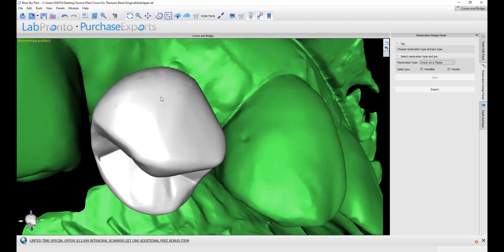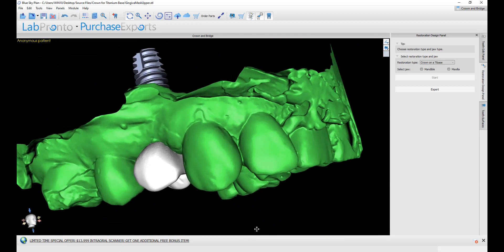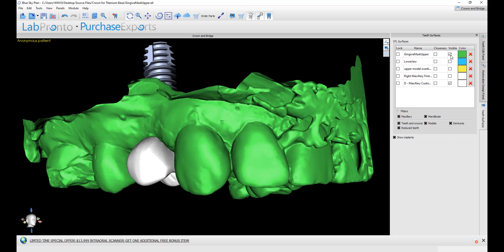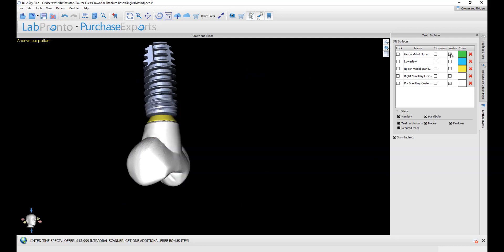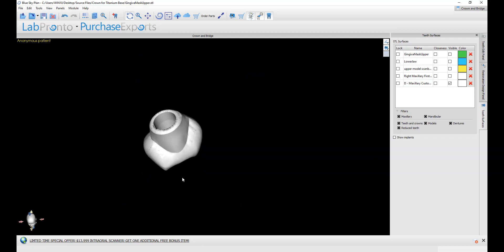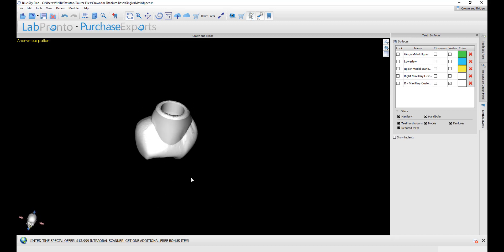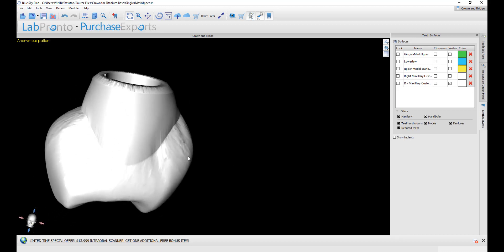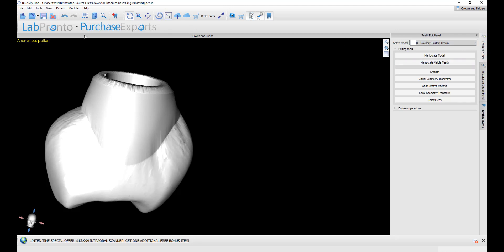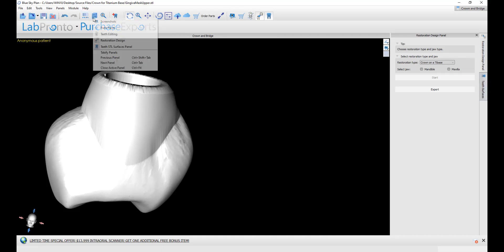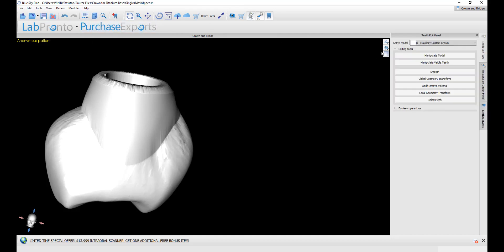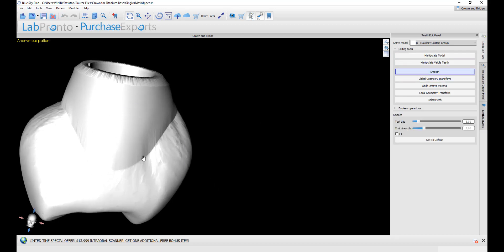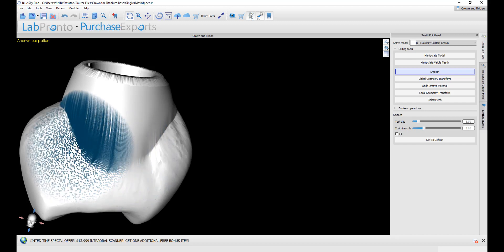We could see our model together with our crown. We could go to the surfaces and here we could toggle on and off different surfaces. We could see our resulting crown. If we want to do any additional editing, smoothing, whatever, then you could go to the teeth edit panel. And if that's not visible, you could activate it by going to teeth editing. Select the relevant surface from the list. The D indicates that this was the designed surface. We could go ahead and use any of the editing tools to do any additional editing that we want to do.